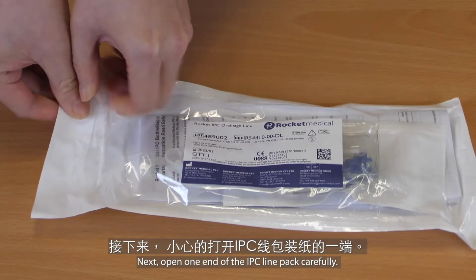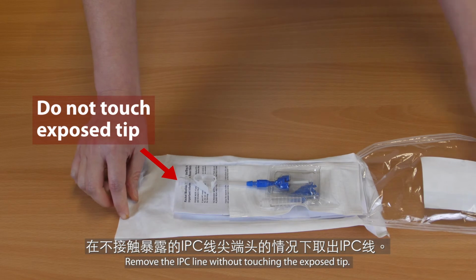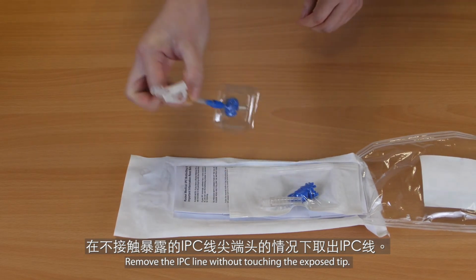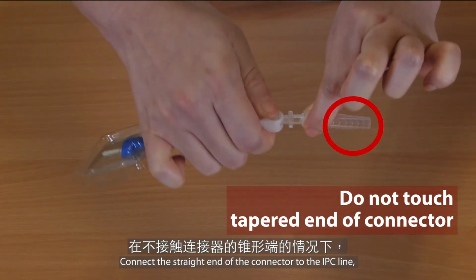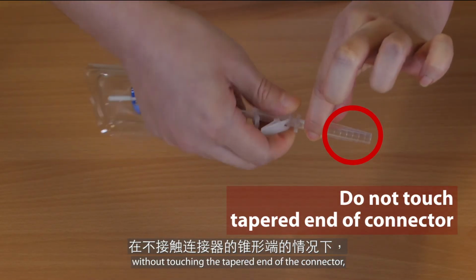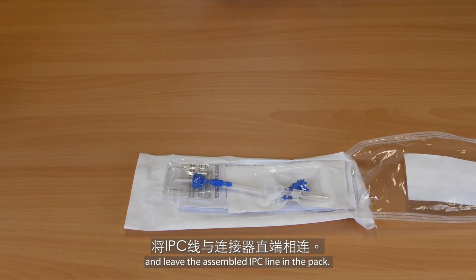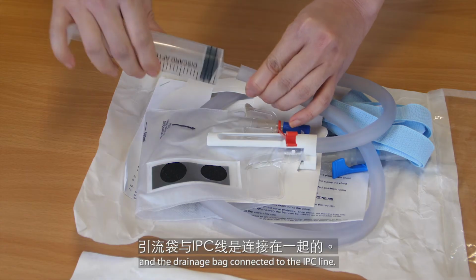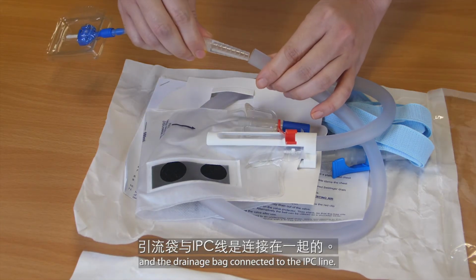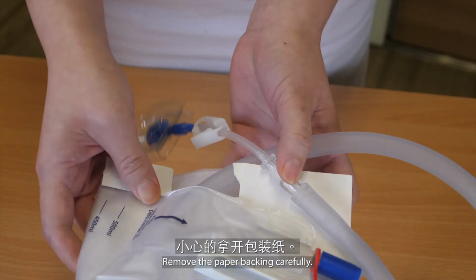Next, open one end of the IPC line pack carefully. Remove the IPC line without touching the exposed tip. Connect the straight end of the connector to the IPC line without touching the tapered end of the connector, and leave the assembled IPC line in the pack. At this point, the syringe can be removed and a drainage bag connected to the IPC line. Remove the paper backing carefully.